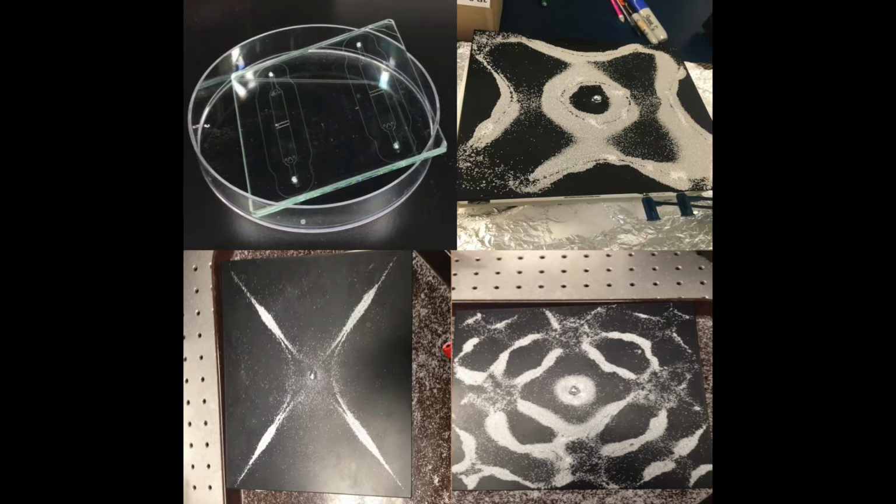This was successful. We were able to pump a syringe to create flow and capture beads in the channel as they flowed by. Note that a requirement for a final prototype would be a high flow rate. However, in the context of this class and the resources available, our performance specification is to see any flow rate at all with combined focusing. We did in fact find that this was the case.